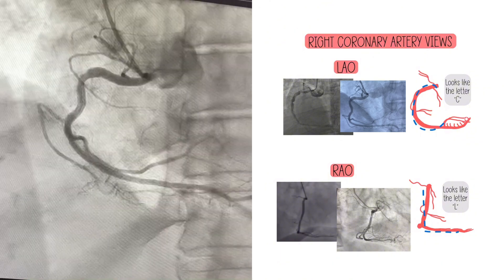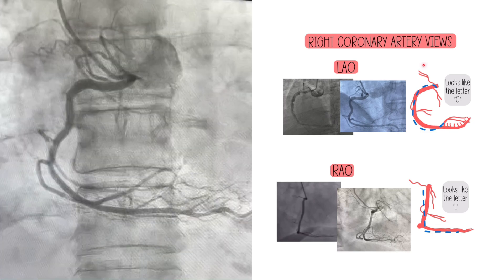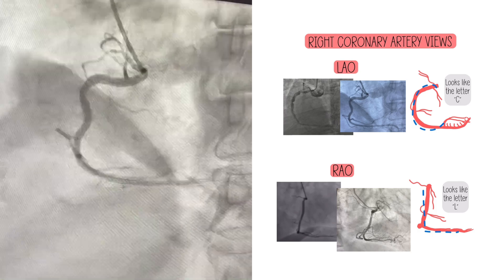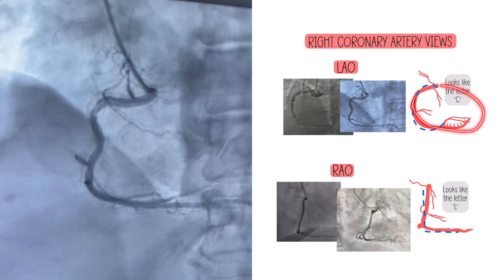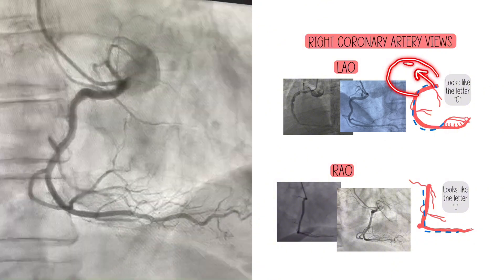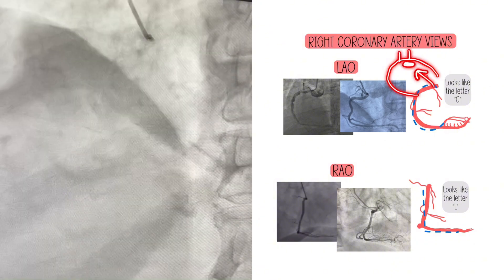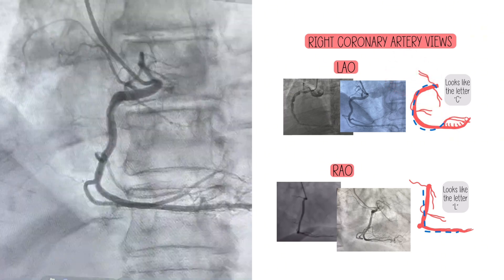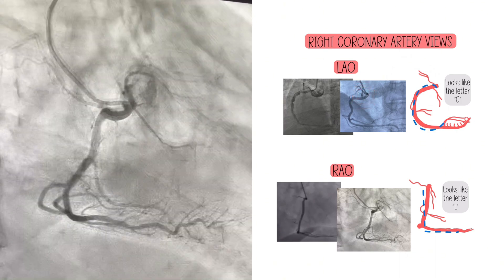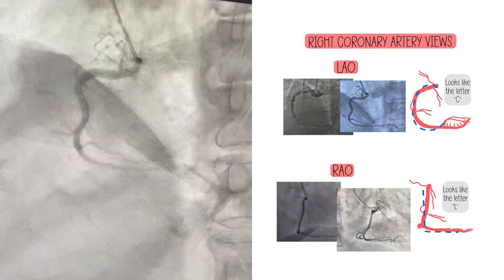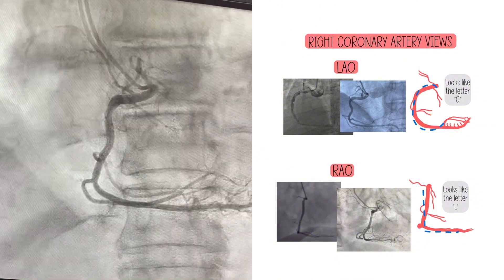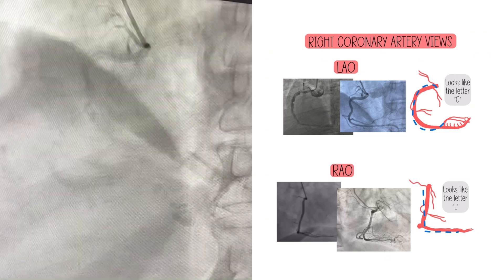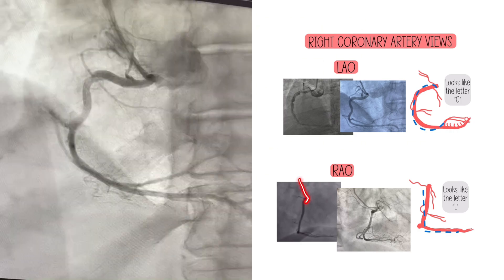Here we can practice the RCA anatomy we learned — the SA nodal branch and the conus. The difference between them is directionality: the conus goes toward the right ventricle, while the SA nodal goes in the opposite direction because the SA node is in the right atrium up by the SVC. You can see two different vessels in the proximal segment in some images, but not all of them. Sometimes the conus has an anomalous takeoff with its own ostium.